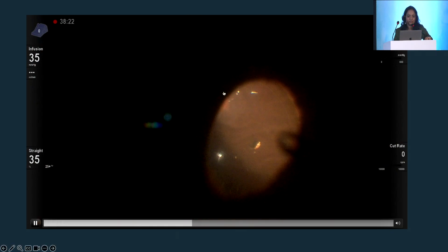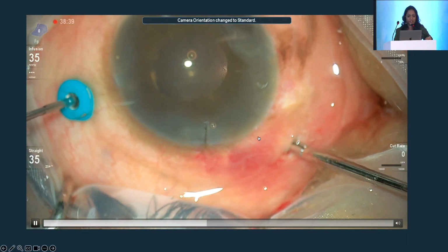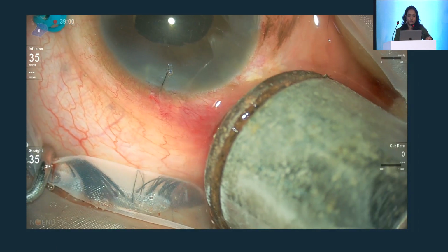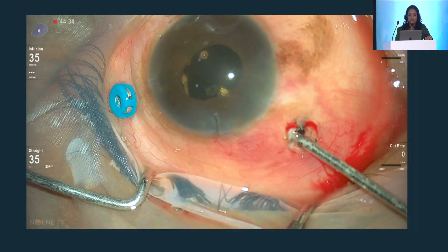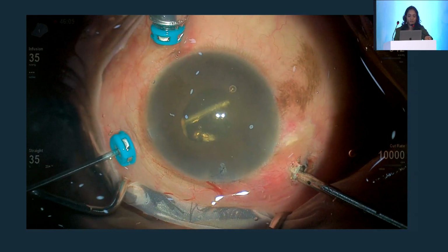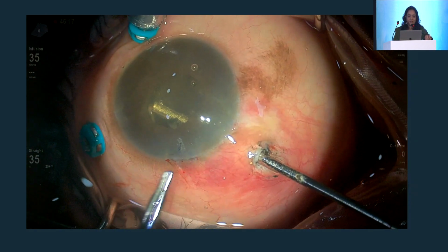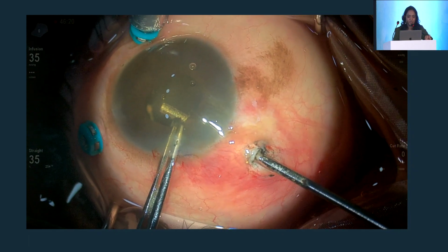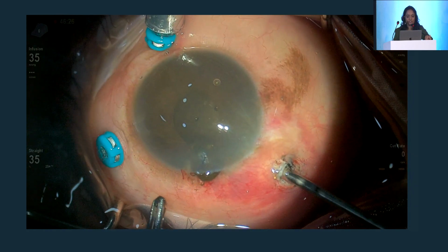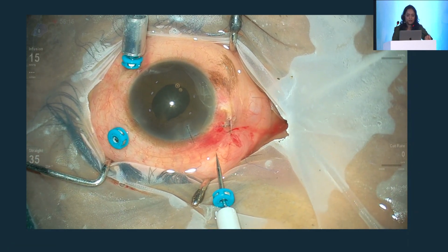ions, ferric ions. Now, I've placed the PFCL inside, and again I used a magnet, intraocular magnet, tried with an external magnet, didn't work. Although I can feel the metal on metal, it's just refusing to come out. So I went in with the intraocular magnet, made sure I removed and freed all the vitreous around the foreign body as well as near the base, and then chose to remove this foreign body through the limbus under viscoelastic protection. And then sutured the sclerotomy and the limbus and completed the vitrectomy.